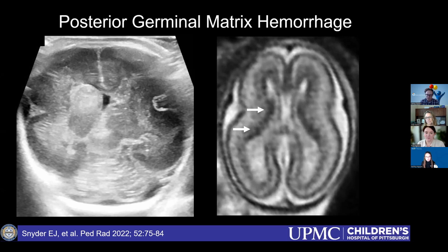But I do have a piggyback question. The NICU will always push us to give, obviously, a grade, and I try to, but on follow-up I find that kind of difficult too, because is the grading based off of just the initial, or is it a continual evolution? I don't know if that's ever been established. Can we regrade, change it, upgrade? What do you guys feel about that?